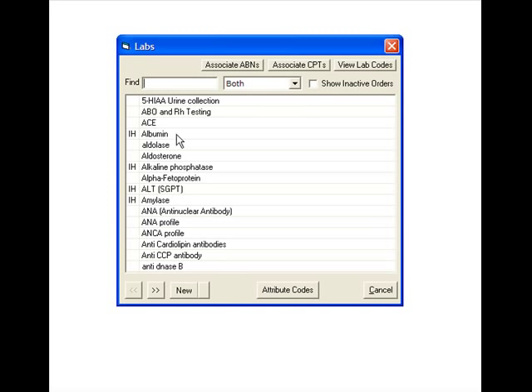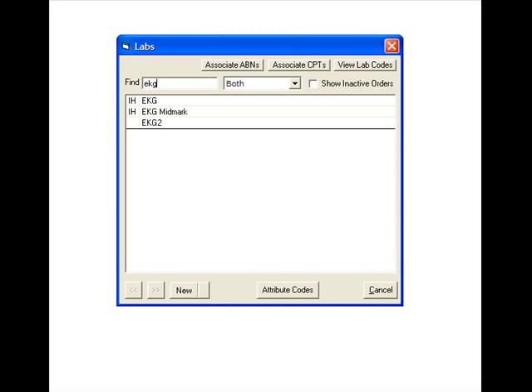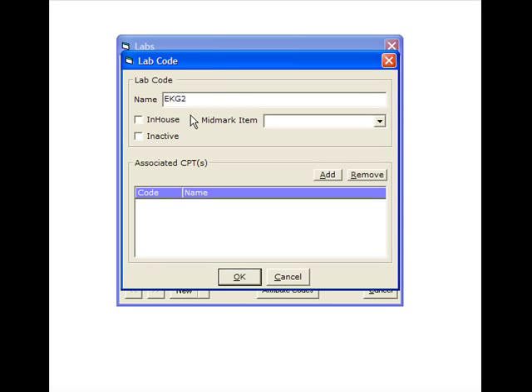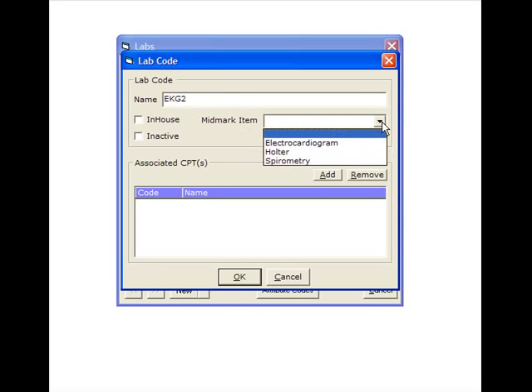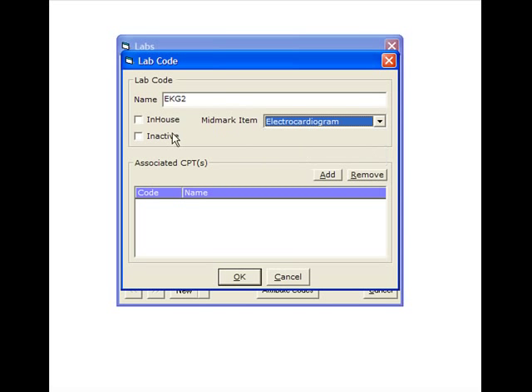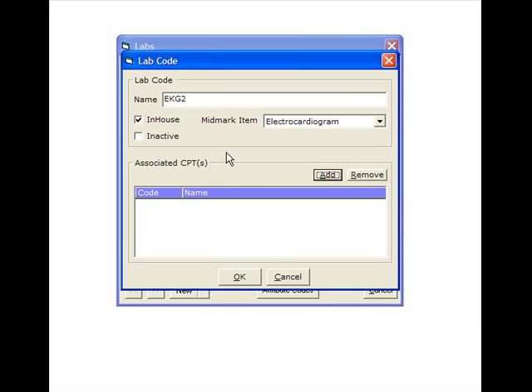Then we'll search for that item that we just created. We'll double click on it to edit it and we'll tell it that it's a Midmark item, electrocardiogram that is in house.